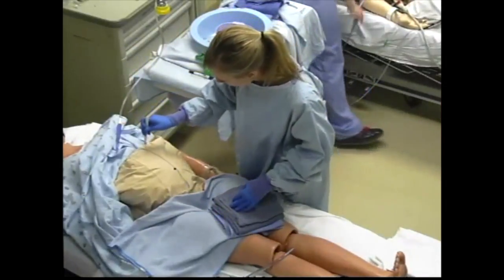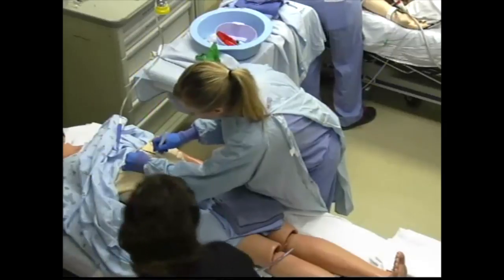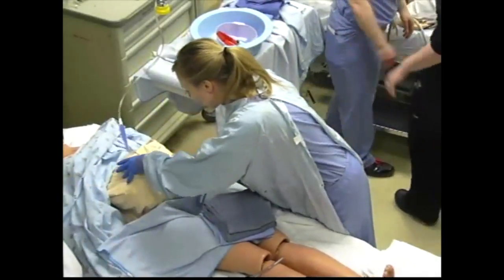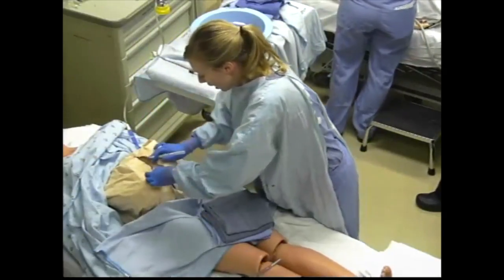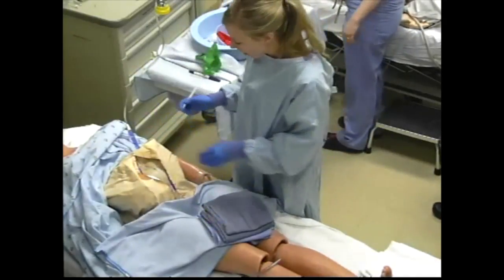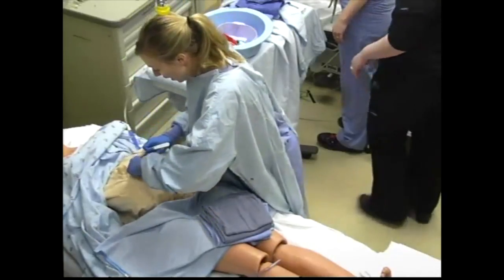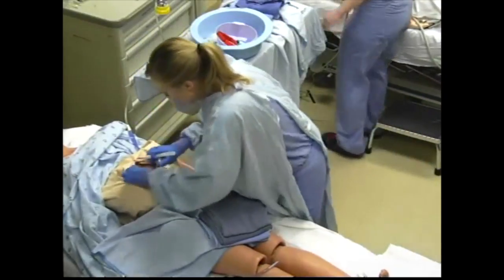Yeah, so we'll do two minutes, then check a pulse — less than 10 seconds. Do we have a pulse? I hope not because I'm doing compressions. Thanks for the water. Any other tools, like some sort of kit? What tools are you supposed to be using? I would like some clamps — bladder retraction possibly. Okay, I'm getting it open. I'm doing it. Somebody's coming. Suction for the baby's mouth when it comes out. I've got suction for the baby. There's my baby.